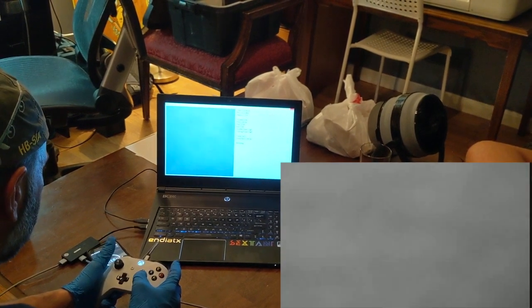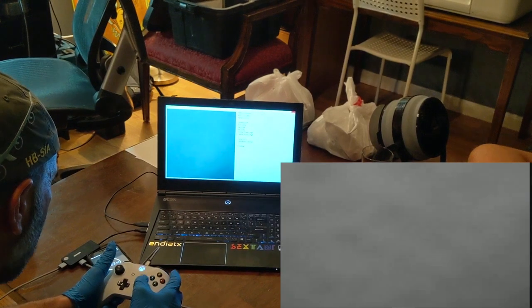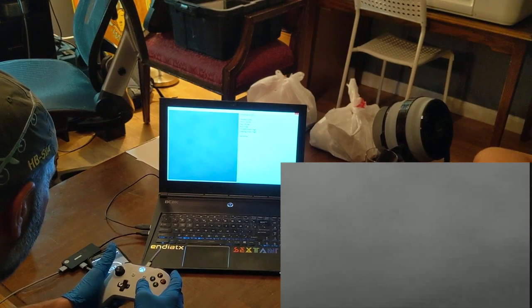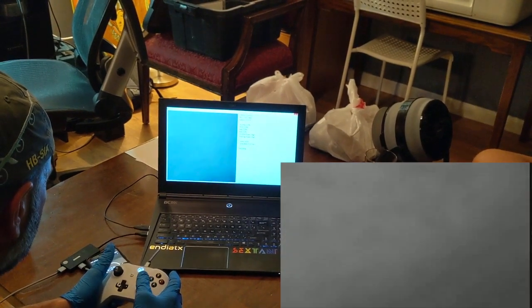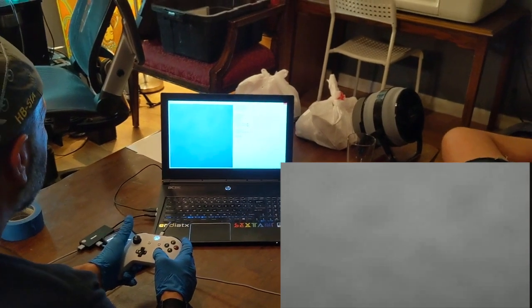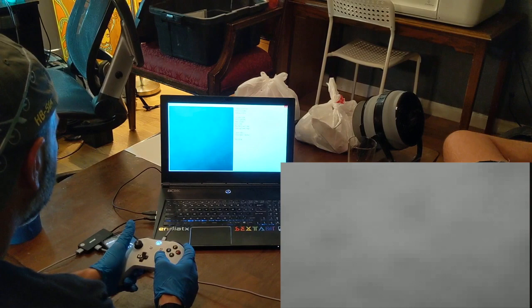And then I'm going to go backwards now. I'm going to go back and see those features. The stomach has a texture. A lot of texture. And it should be noted like we were a little hazy with our view window for this. That's some good texture there. So like as we resolve those little issues we're actually going to get a lot more.